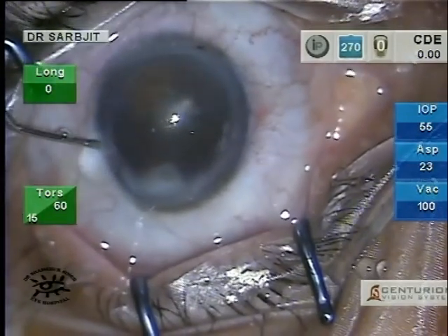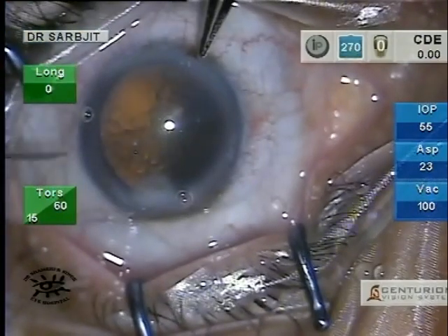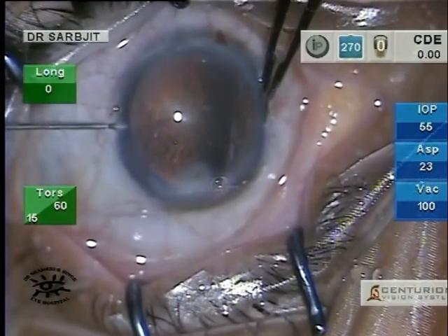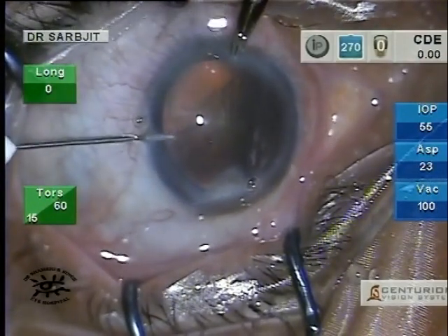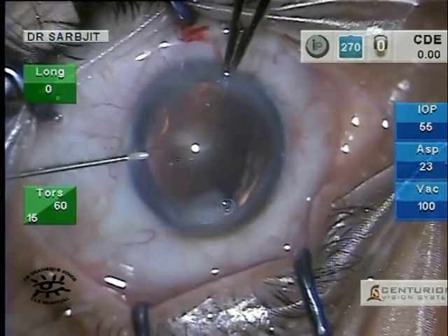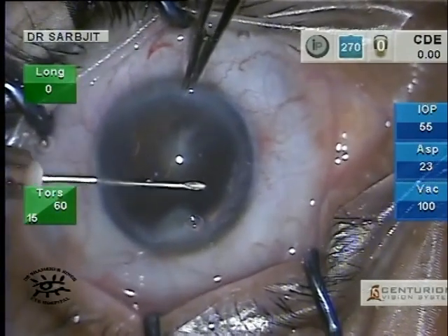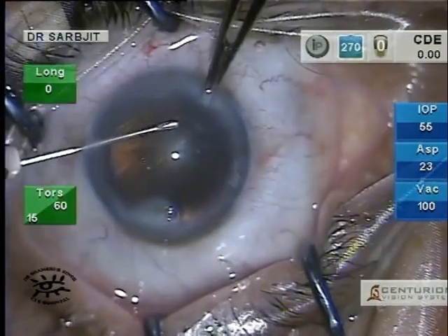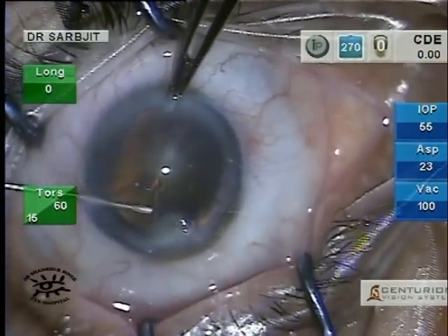This case also has a corneal opacity at seven o'clock. For my capsulotomy I use a needle track — a 26 gauge needle to make that track. I find with this method the anterior chamber stays deep and the capsulorhexis is made simple and safe.